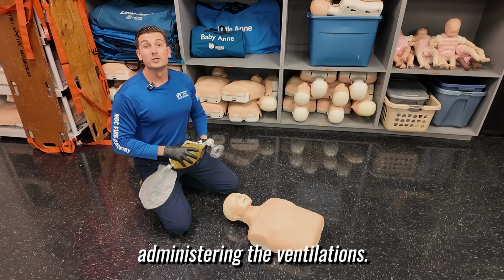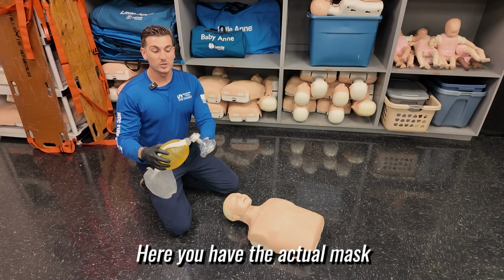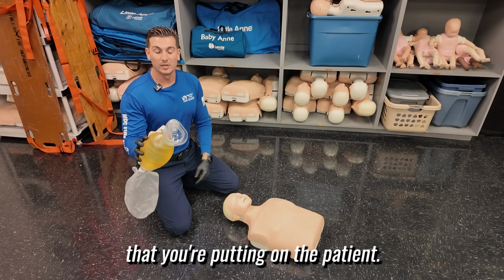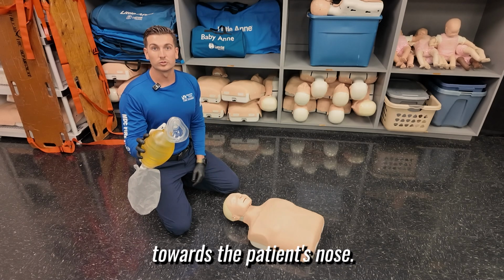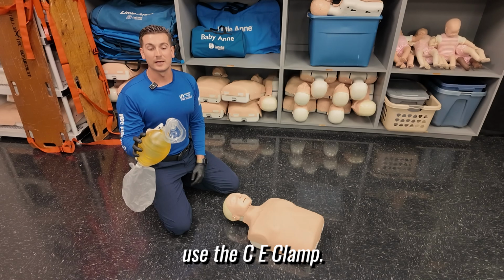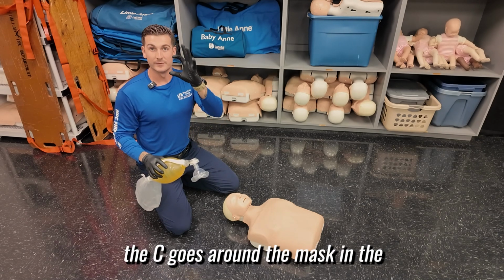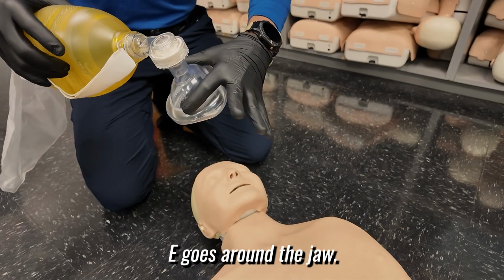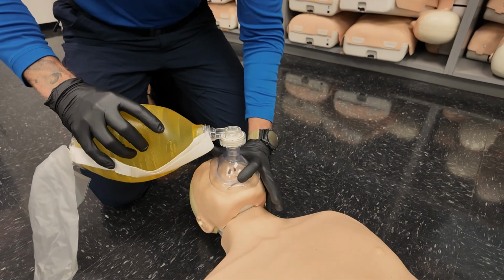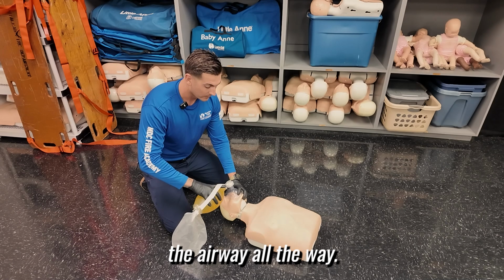Now we're going to talk about administering the ventilations. Here I have a BVM, or a bag valve mask. Here you have the actual mask that you're putting on the patient. The apex, or the pointy part, goes towards the patient's nose. The way that you carry this is you use the C-E clamp. The C and the E. The C goes around the mask and the E goes around the jaw. And you're going to open up that airway all the way.